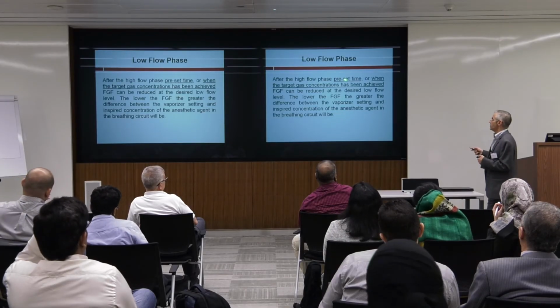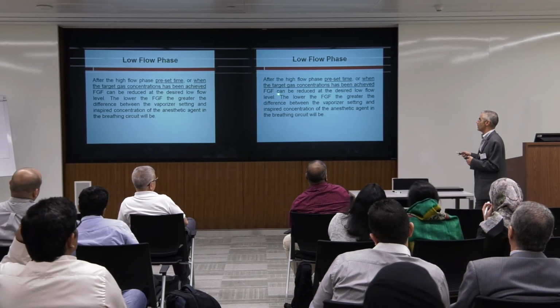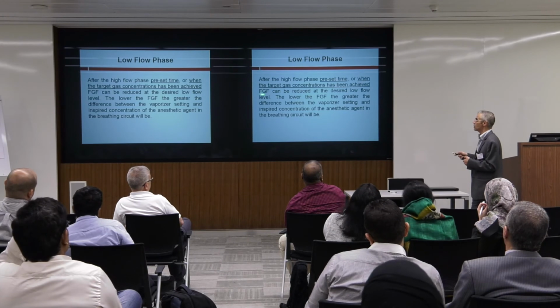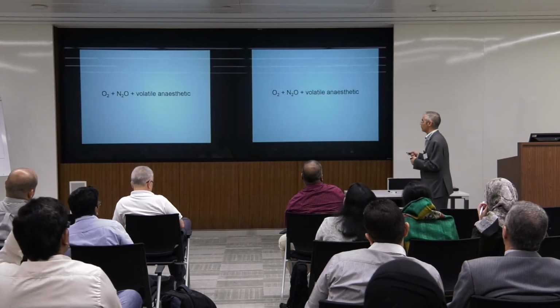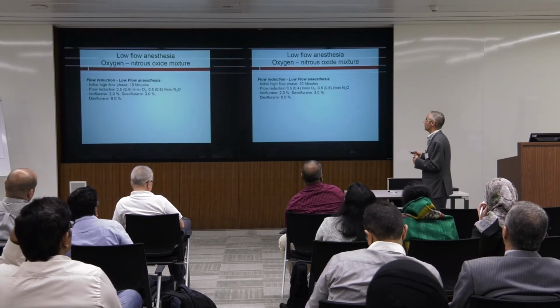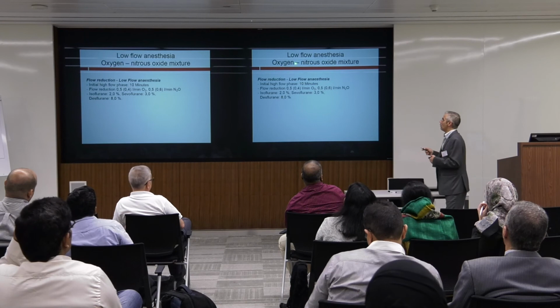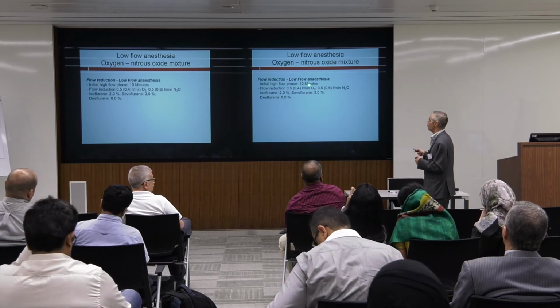After the high flow phase, preset time, or when the target gas concentration has been achieved, the fresh gas flow can be reduced to the desired level. So we will start talking about oxygen-nitrous volatile anesthetic. We will start the inhalational high flow phase for 10 minutes.